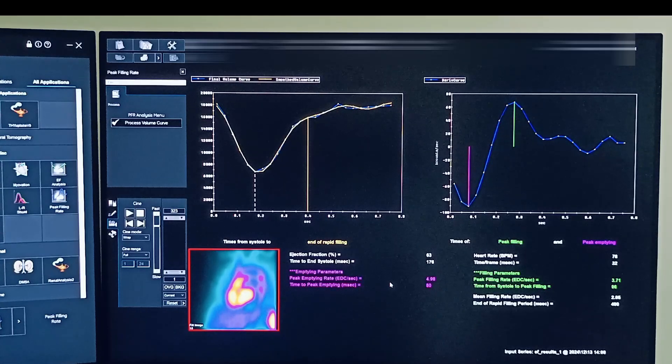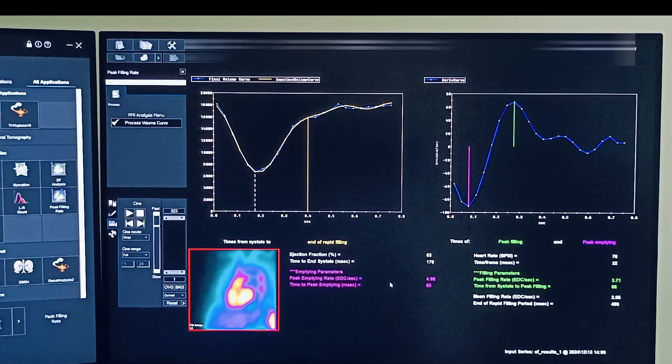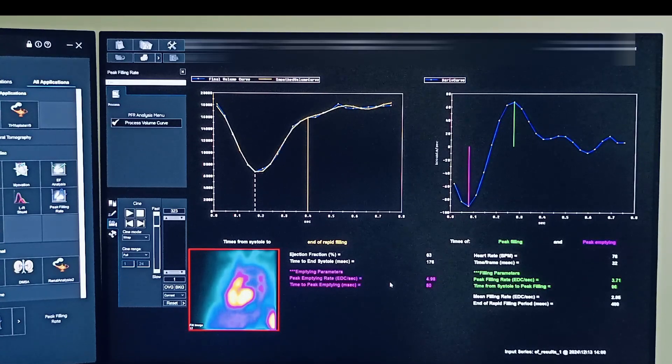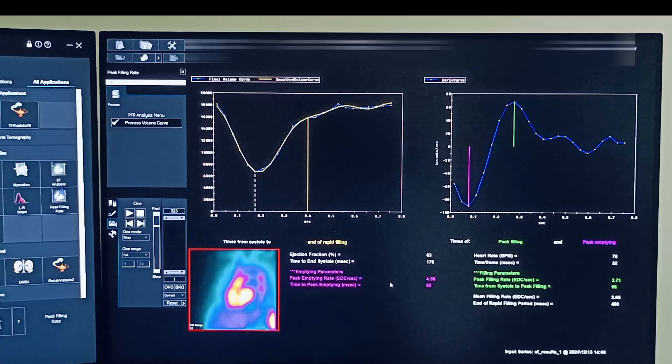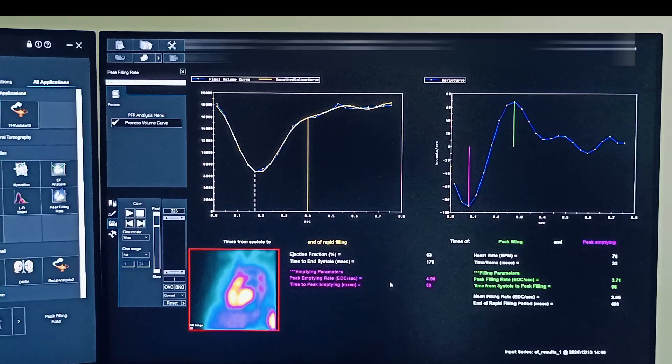So depending upon the patient clinical condition, you can give these results or only the EF.